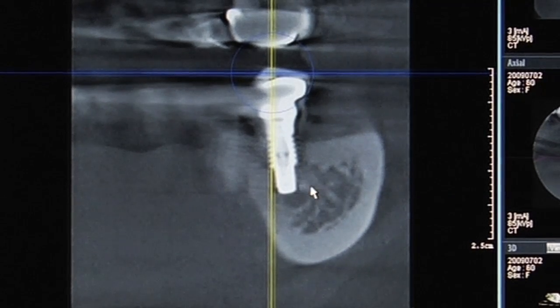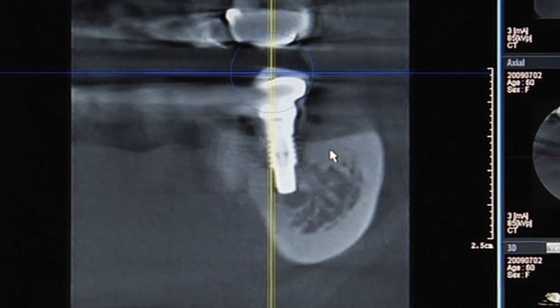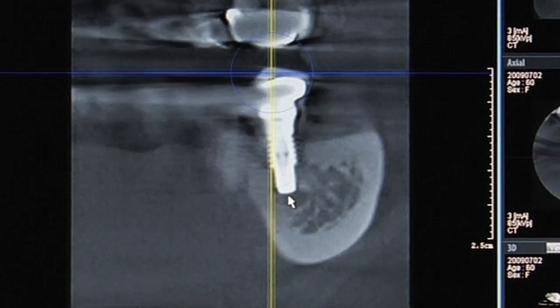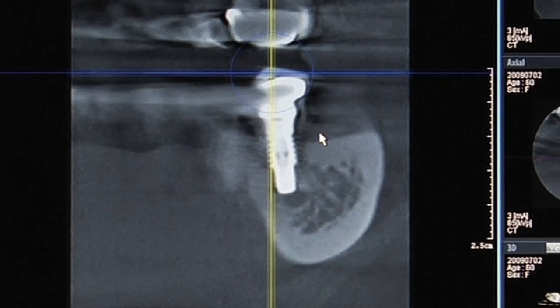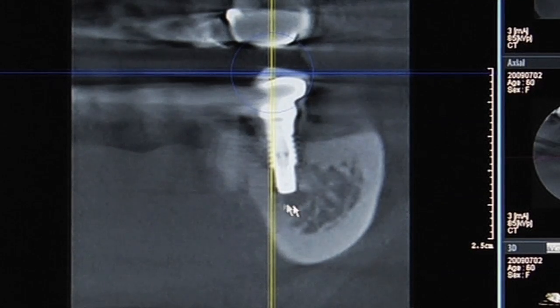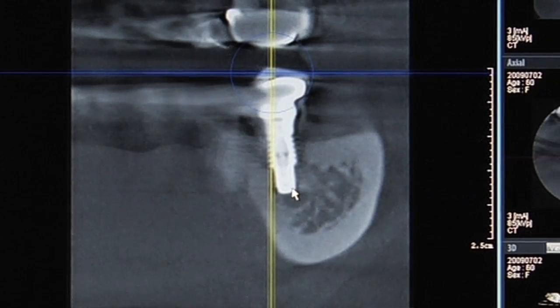At the time of implant placement we got significant bleeding, but we were able to control it and successfully placed the implant — the patient has full sensation. For those of you saying that looks like the mandibular canal, I would agree, but anatomically that is not what we encountered. I believe the canal is here, and the patient has no nerve impingement and has full feeling in their lip.